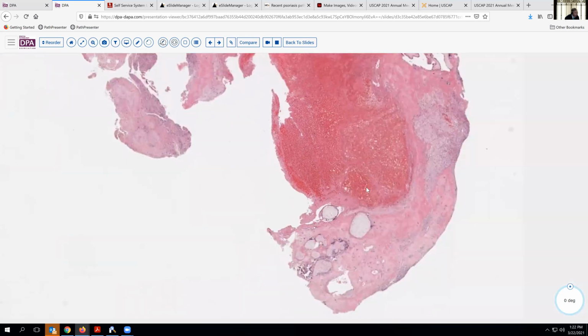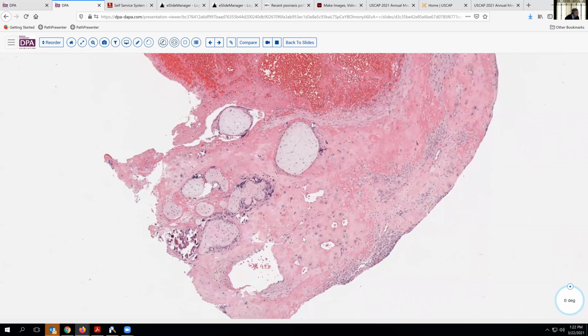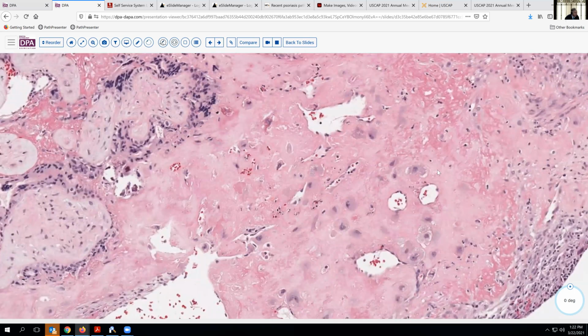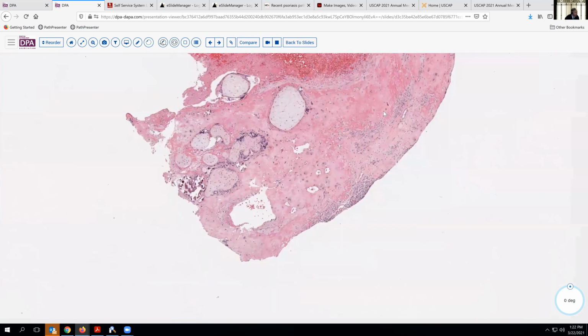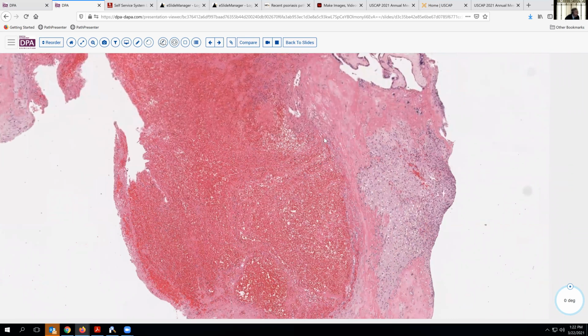Here's another example, one where it's occurring earlier. You've got some entrapped villi, and you can see this intermediate trophoblast here, a very eosinophilic tissue with a little bit of hyaline and fibrin in the midst, and may occasionally encase these old villi. Now, if the villi have all degenerated and you're left with this stuck to the endometrium, it's going to continue to exist there for years and weeks and maybe decades.